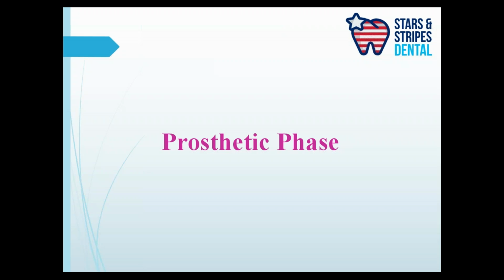Now we are assuming that we have done all of that correctly. We have placed our healing abutment. It's been enough healing time, and now we are ready to take impressions. So today's lecture is mainly about discussing various implant impression techniques and how to do those. Okay, so let's get started.